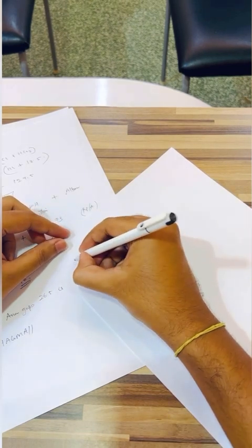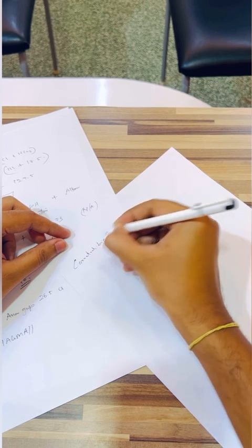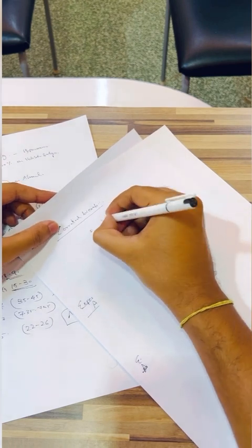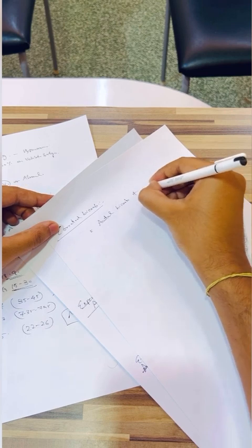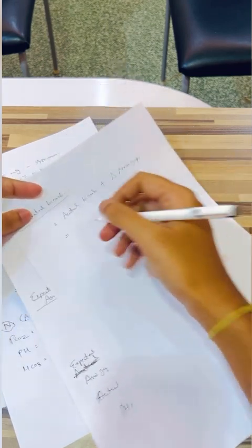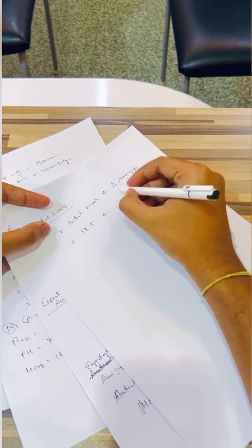That is the corrected bicarb for this patient. We have to check the corrected bicarb for this patient. For the corrected bicarb, the formula is actual bicarb plus delta anion gap. The actual bicarb for the patient is 18.5. The delta anion gap formula is quite simple.